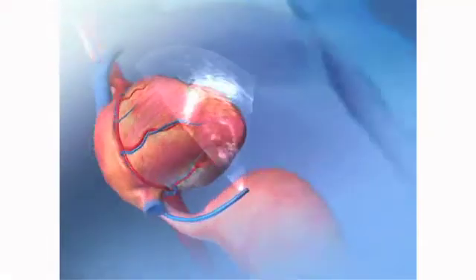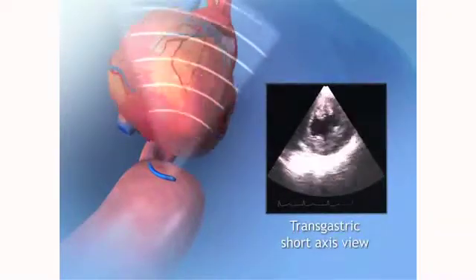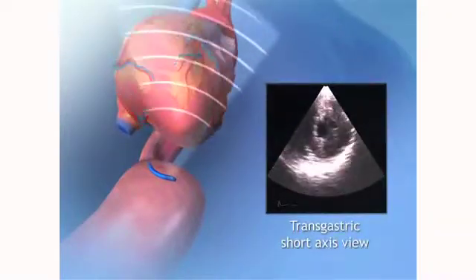Using conventional methods like a Swan-Ganz catheter to try and figure out whether the patient has responded or not to their volume resuscitation, it's taking a fairly long time to get through a fluid resuscitation protocol. And what they have found is that by having direct visualization information with TEE, they're able to get to the right answer much faster.